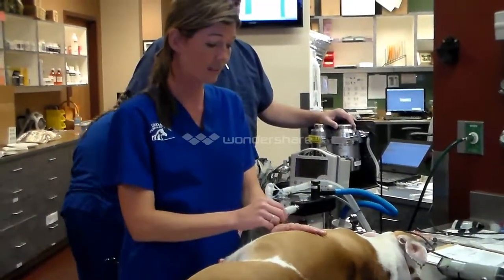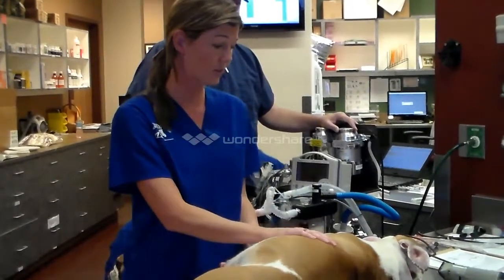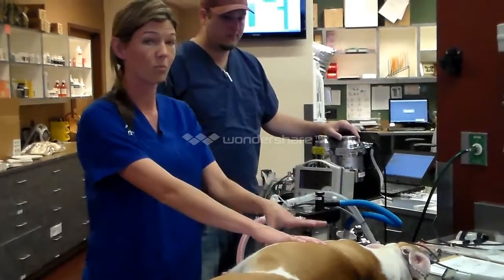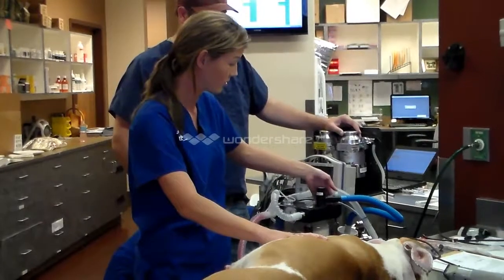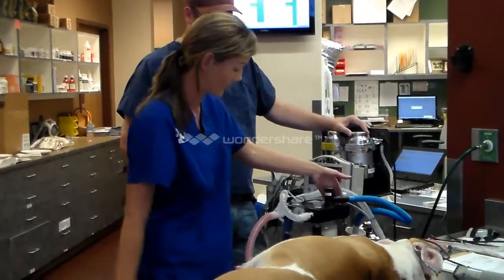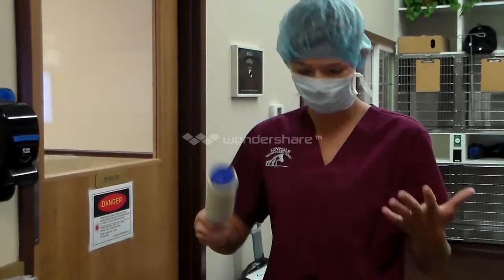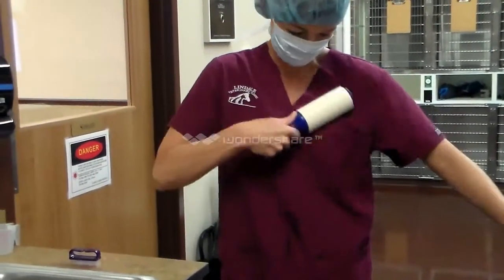On a dog this size, we would be doing compressions at the widest point of her chest. She's in right lateral recumbency, so she's on the right side. While I were doing cardiac compressions, we would have another person bagging her, and they're just going to close this valve, squeeze her bag, watching this manometer, making sure it's not going over 20 centimeters of water. Sterile surgical scrub, so we're going to start off by lint rolling, just making sure that we get any excess hair.